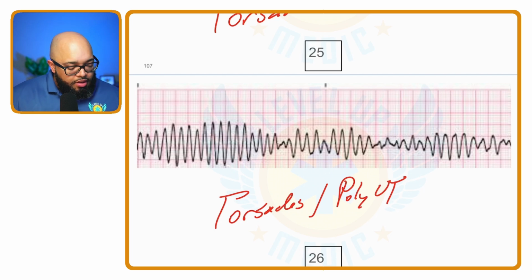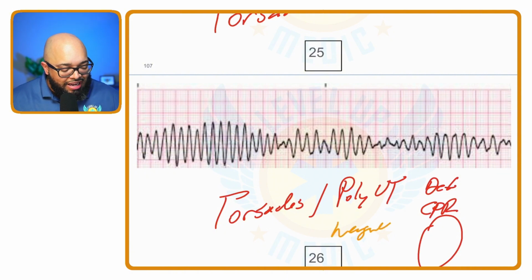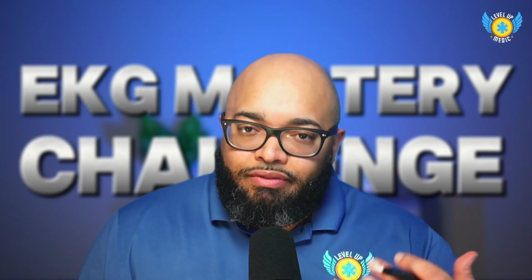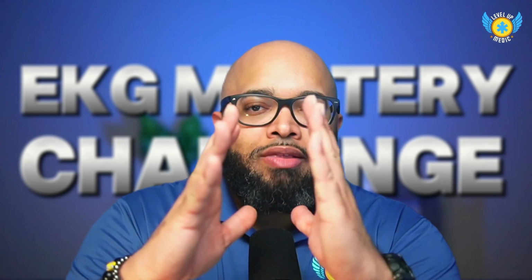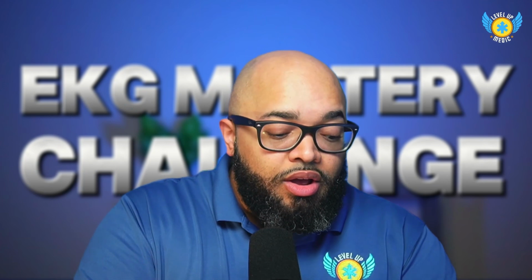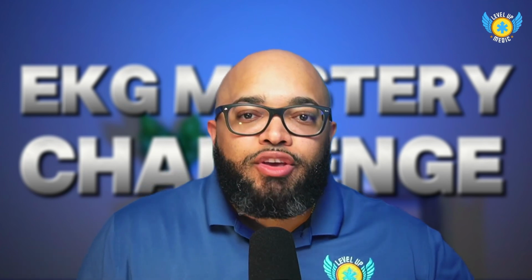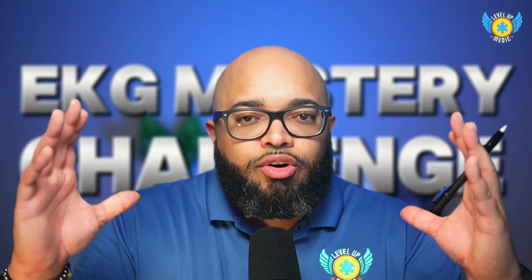Okay, now, chances are they're not going to have a pulse. Assuming they are pulseless, they're going to get defibrillation, high quality CPR, and all the rest of the cardiac arrest treatment. But one thing that does change here is they're also going to get magnesium. Follow your protocols, but the purpose of the magnesium is to shorten that QT interval so that hopefully you can get them out of this fatal rhythm and back into a normal perfusing rhythm, okay?